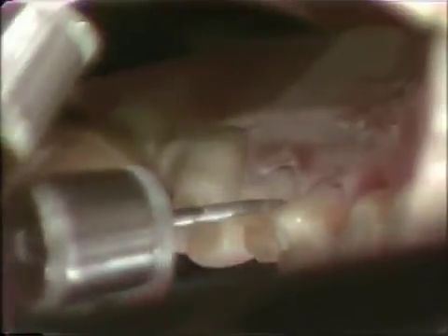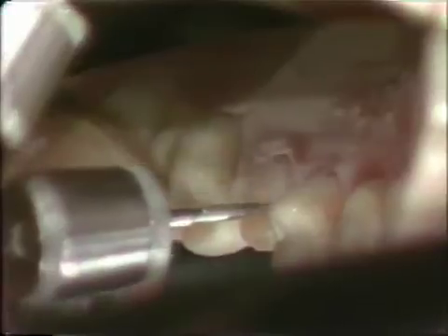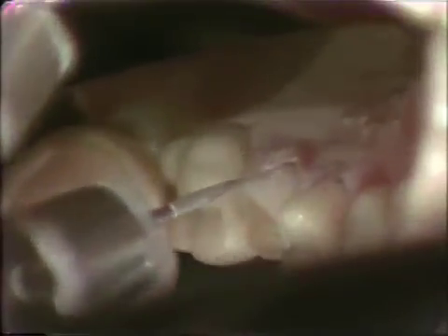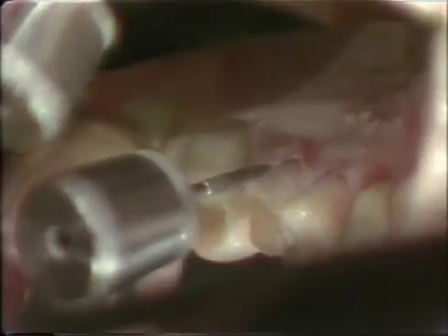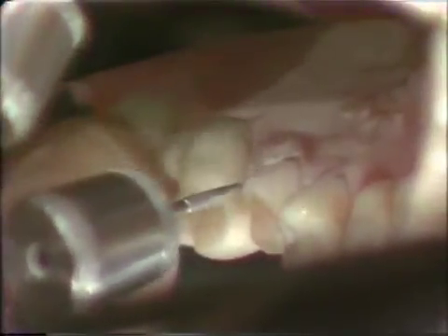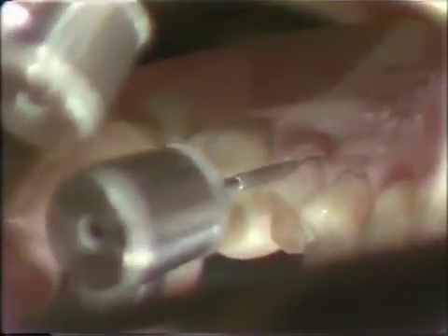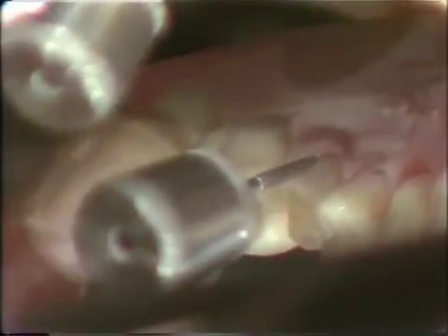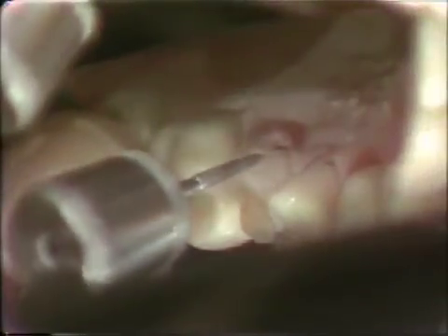The reason this diamond is not used for the interproximal is that it is a little bit bulky and would tend to cut the adjacent tooth. We will try to keep the finishing line in this particular instance above the soft tissue, again trying to use a high speed and a light touch.